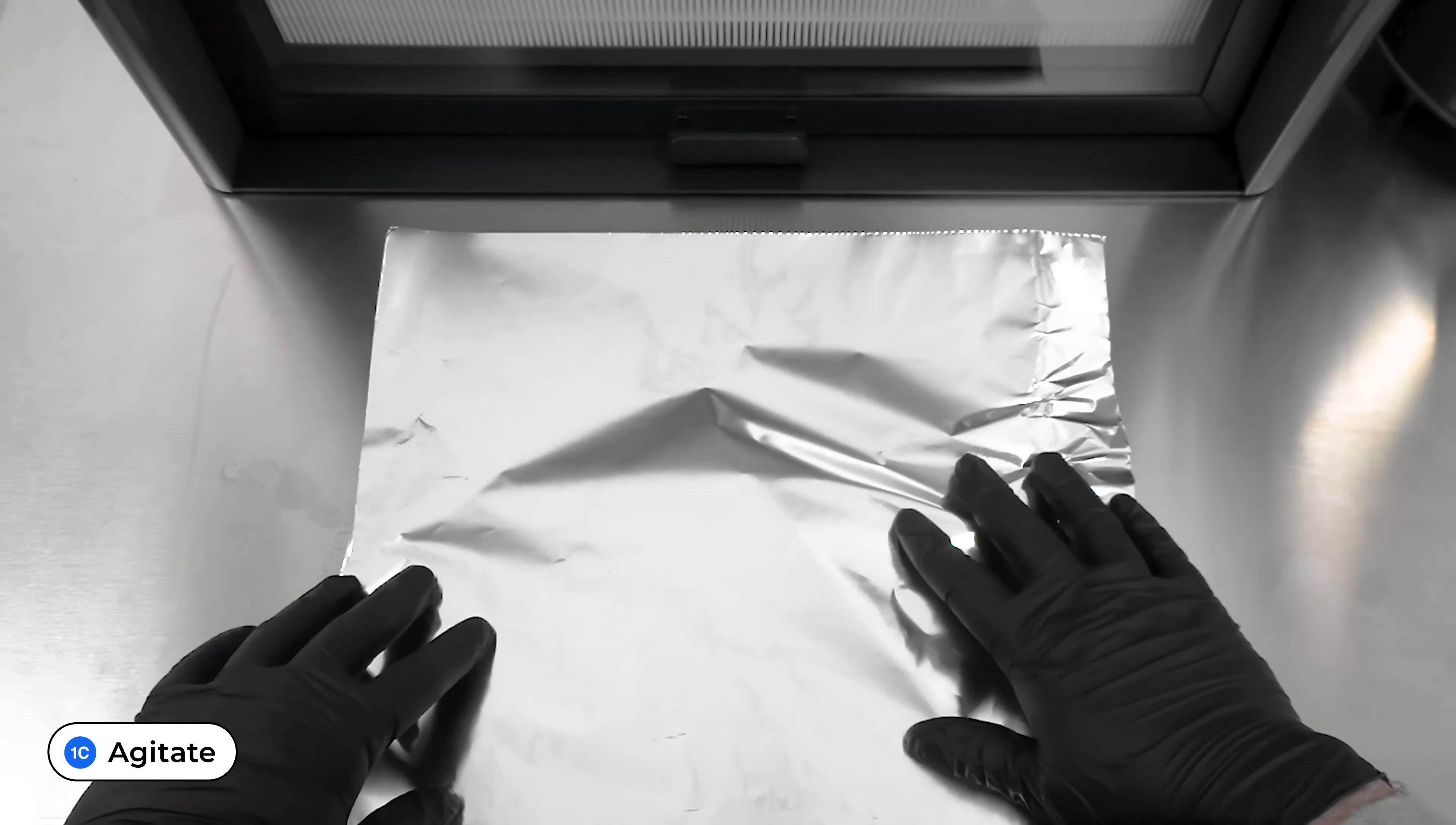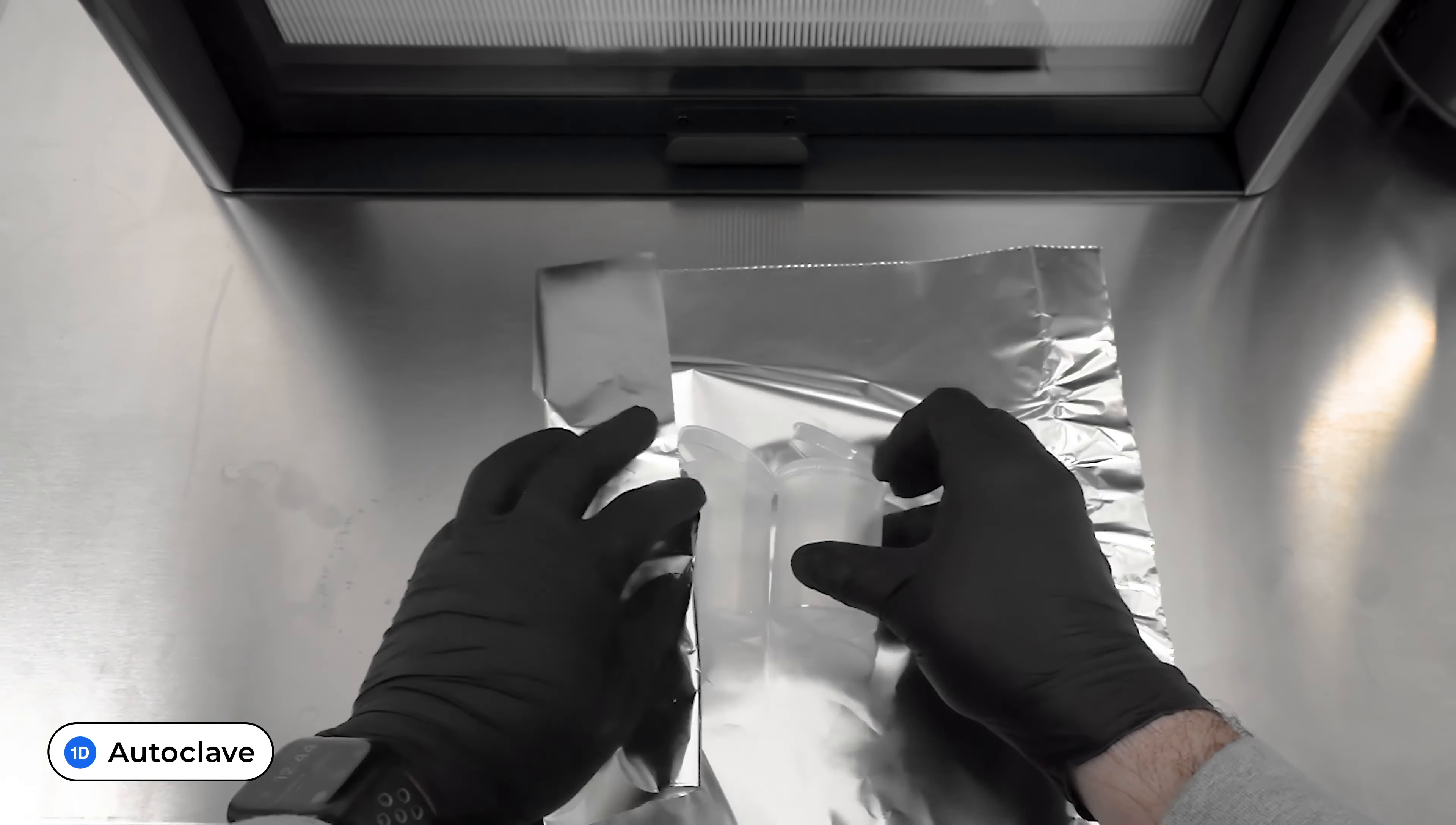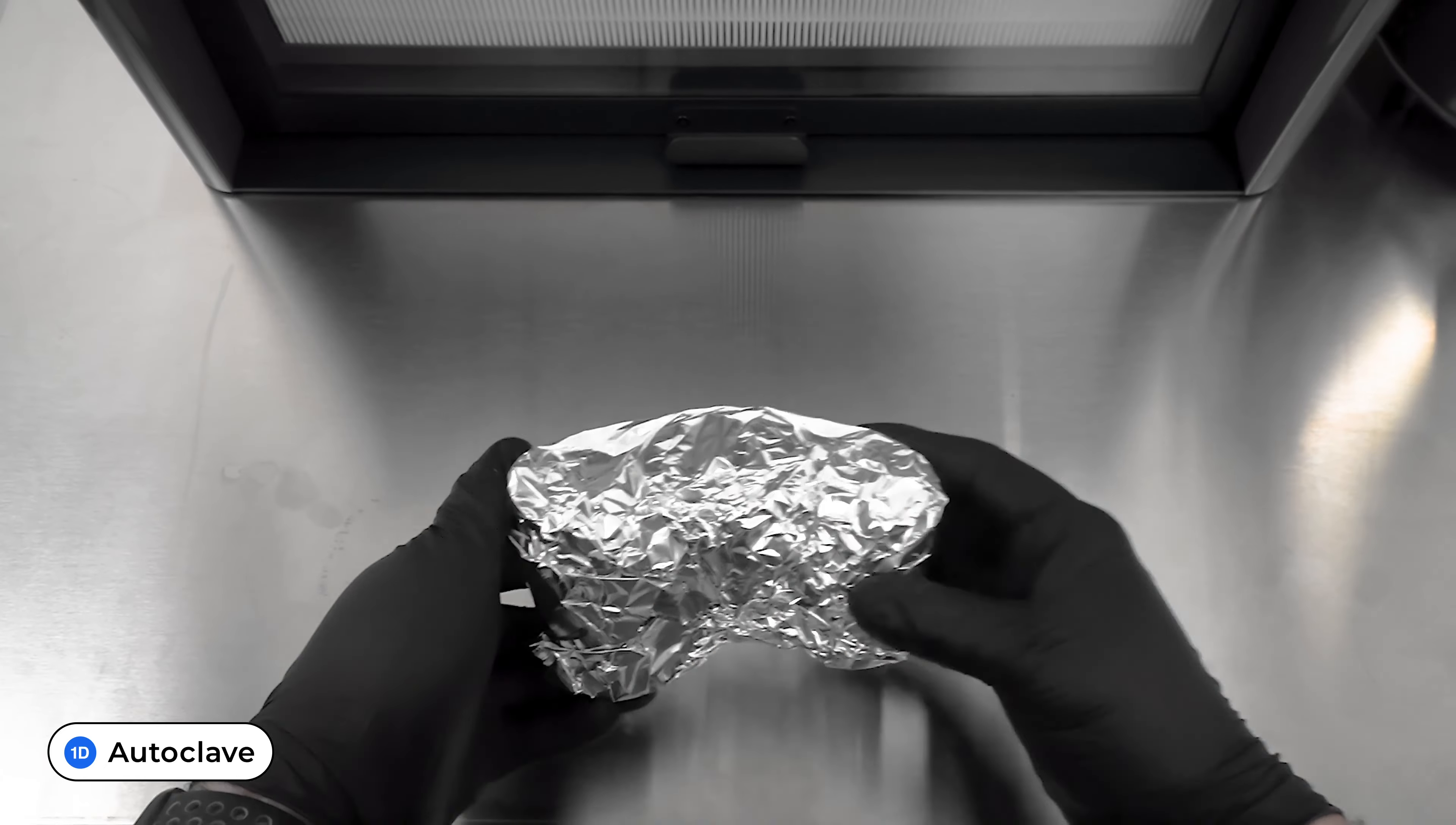For autoclave use, culture vessels should be wrapped in foil prior to sterilization. Once sterilized and covered in foil, they can be put aside for future use.